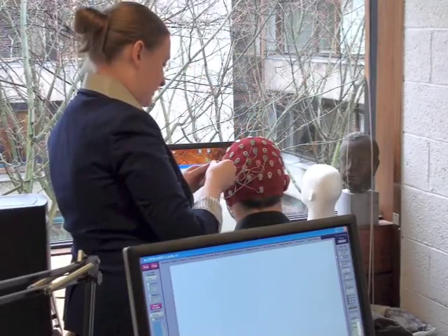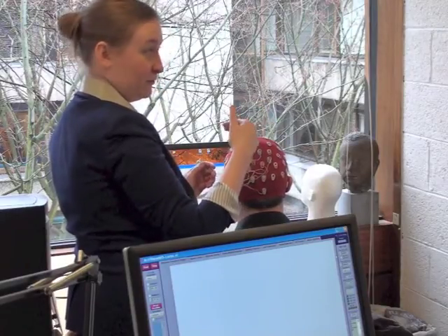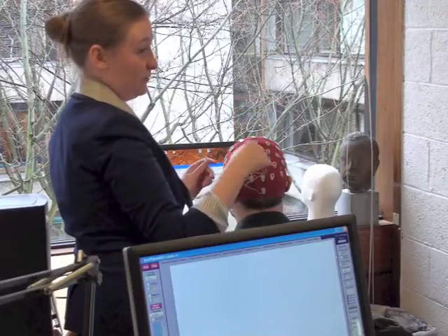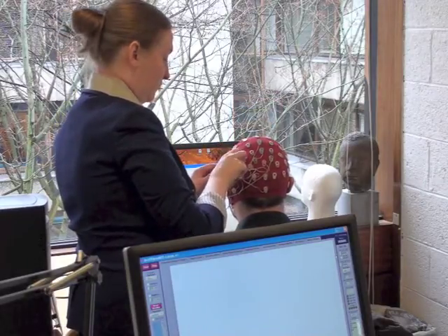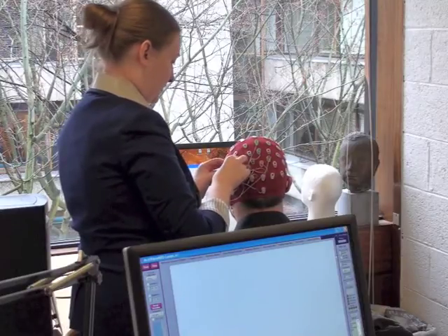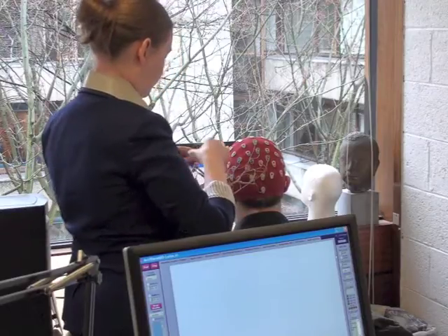Normally when we're looking at a screen, we tend to be looking away quite a lot. But when you're doing an experiment like I'm going to be doing with Brent, he has to look at it the whole time and press buttons. So your eyes get incredibly tired. People's eyes have been watering throughout these experiments. And then add to that the cognitive tasks they might have to do for some studies.